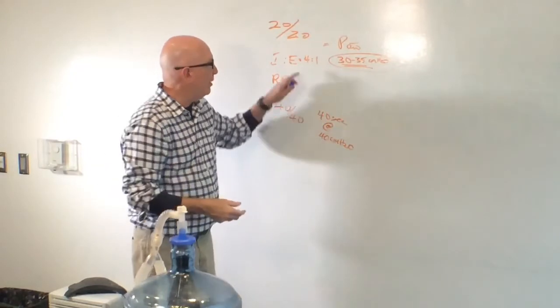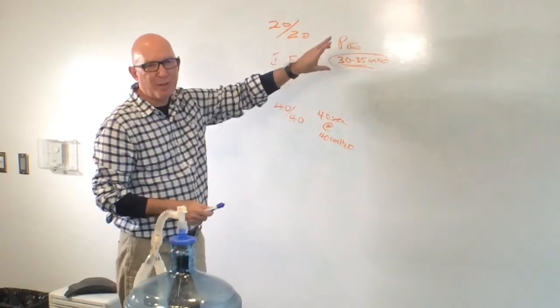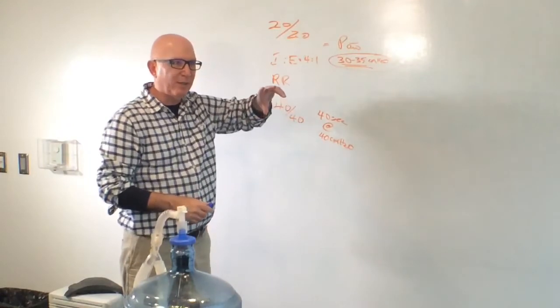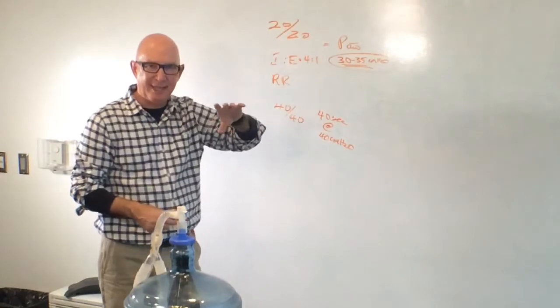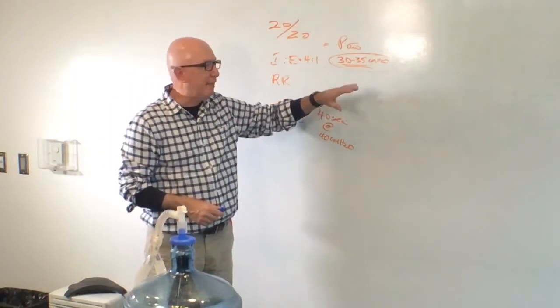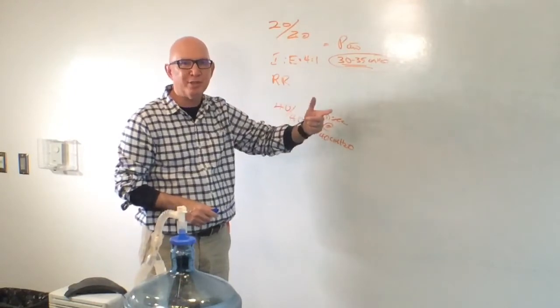So with our particular recruit maneuver, once you perform the maneuver, we increase the PEEP by 2 above what it was prior to the maneuver itself. So you've performed the maneuver, increase the PEEP, and see whether that sustains the gain in oxygenation that you achieved with the maneuver, if indeed there was one. And if your SATs deteriorate at that point, you can repeat the maneuver as well.